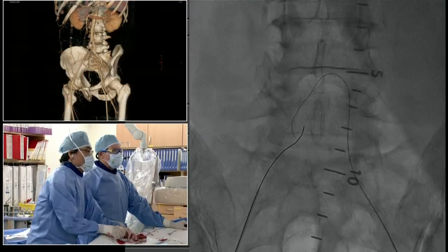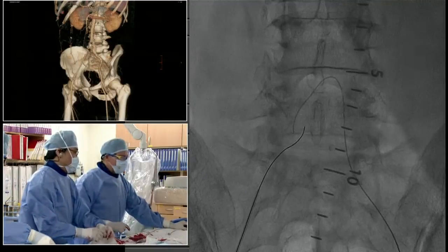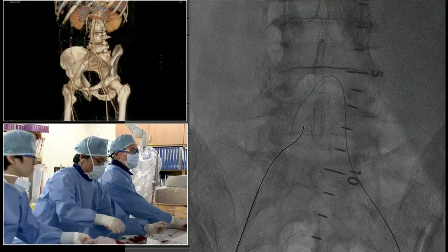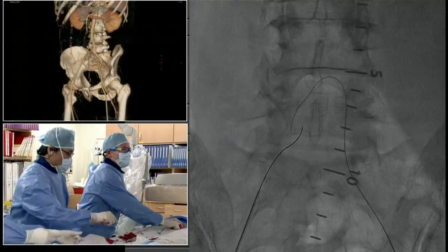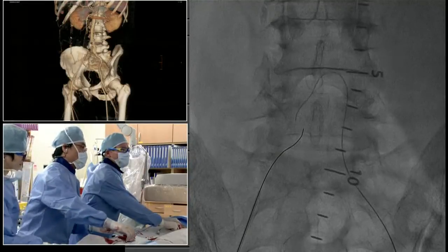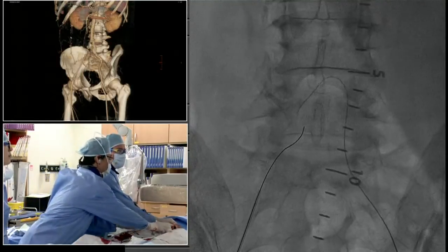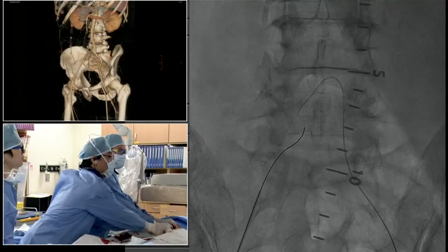Well, the team got access both to the left groin and the right groin, which is nice. And so we've gone through the right side, couldn't do much. All I managed to do is try to get subintimal. So decided we go contralateral. Now I've gotten the wire about 2-3 centimeters across the CTO with a glide wire. And so what we're going to do is go up with an Ansel contralateral catheter because we've made some progress. We may lose it, but we're going to try.